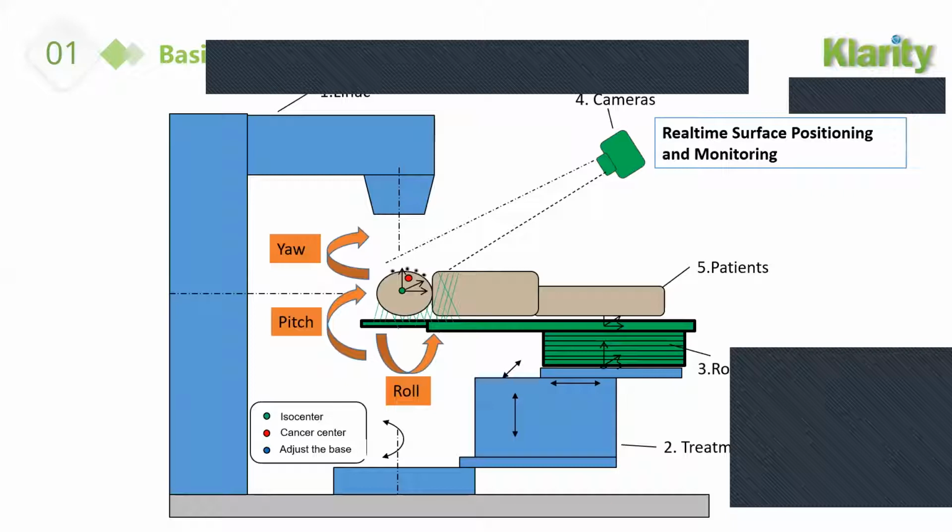And with the cameras, we can have real-time surface positioning and monitoring. And we also can have the respiratory gating.